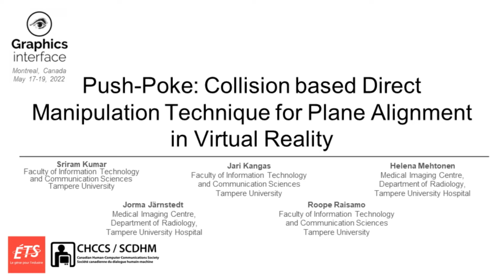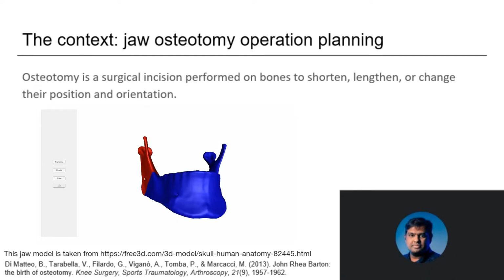This research work was carried out in Tauchi Research Unit at Tampere University in collaboration with Medical Imaging Center, Department of Radiology, Tampere University Hospital. This research was carried out in the context of jaw osteotomy planning.